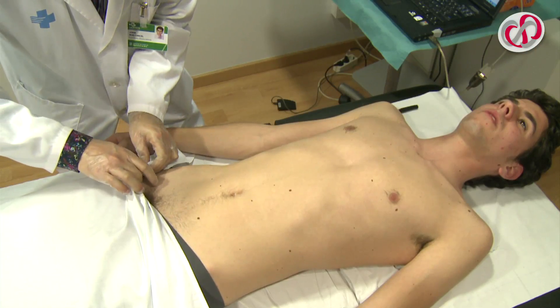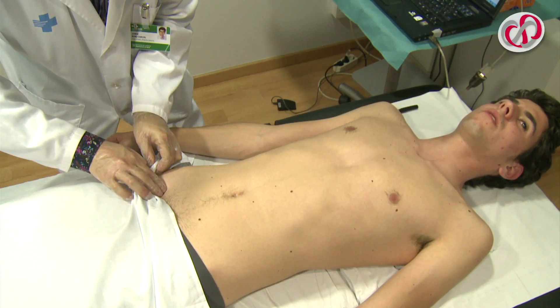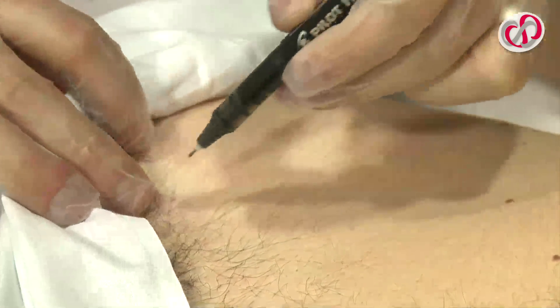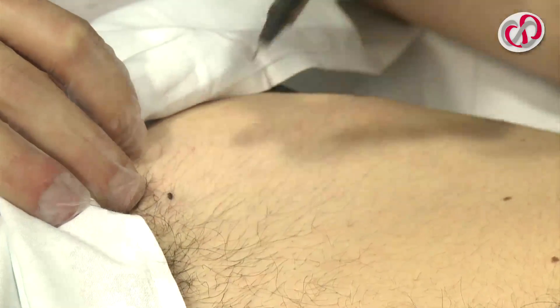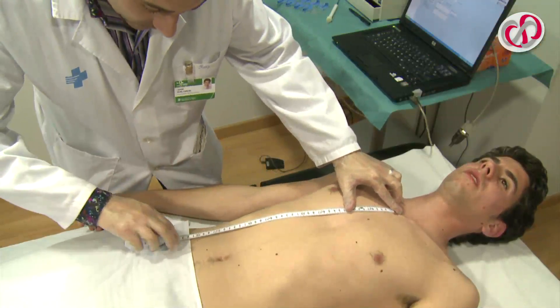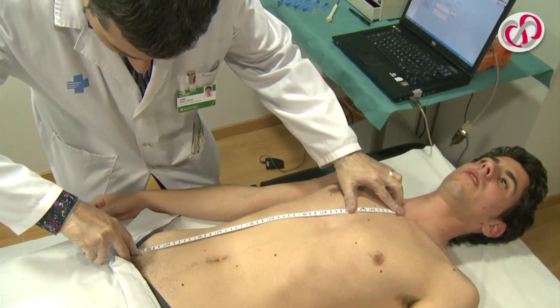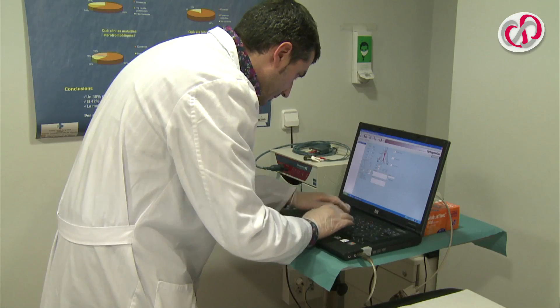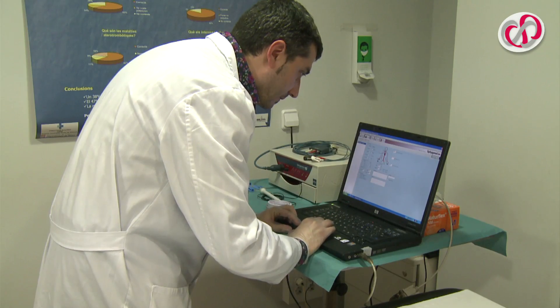Then we measure the distal distance. To do this, we look for the femoral pulse at the internal third of the inguinal fold, where the pulse is strongest, and we mark it out. We then proceed to make a distal measurement from the sternal manubrium to the femoral pulse. The data is introduced into the computer, remembering to enter the distances in millimetres.